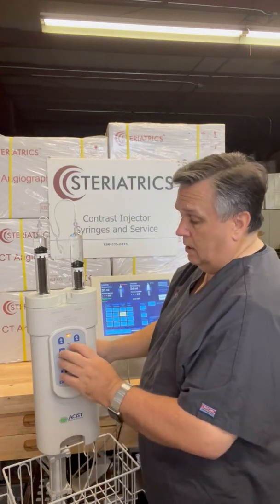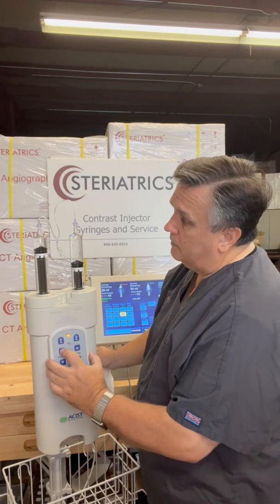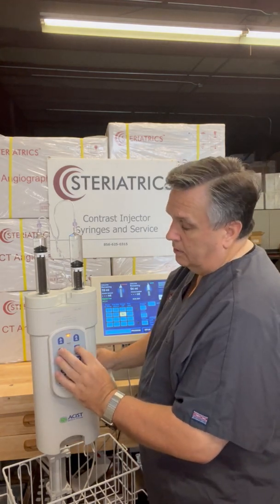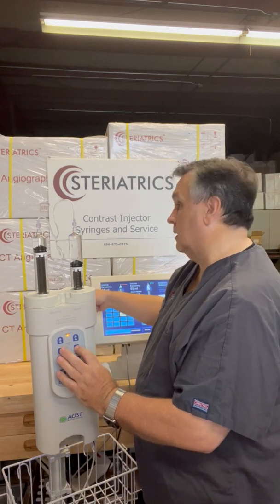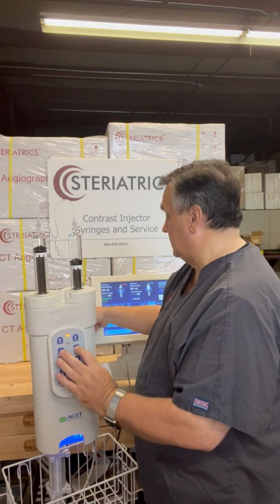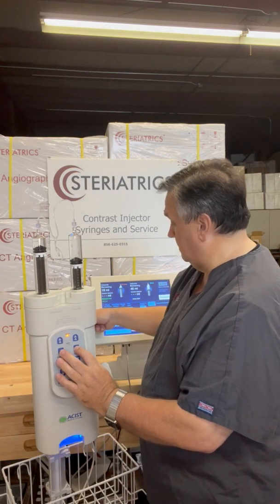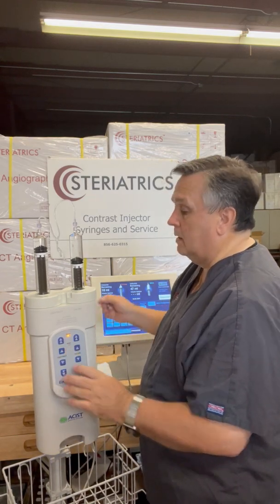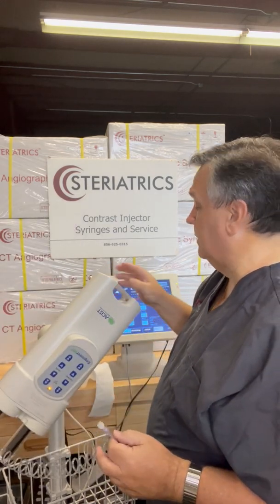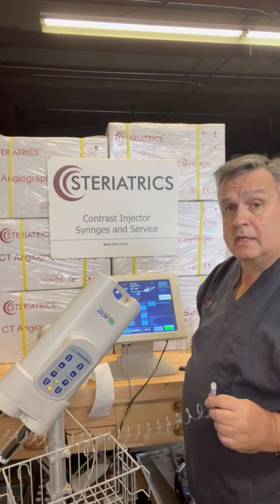The first thing we're going to do is run our contrast up until we just see it hit the Y, and then we're going to run our saline up and dribble right back into our tray. There goes our saline — get some drips. Now we're ready to hook up to the patient. Turn the injector down and we're all set to go.